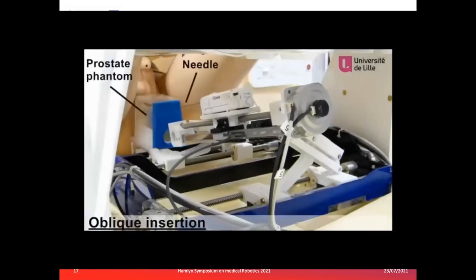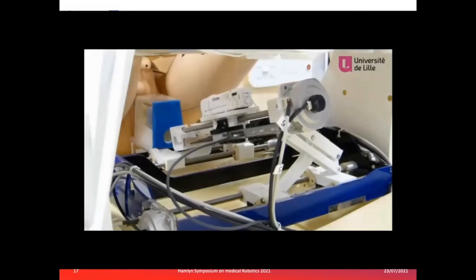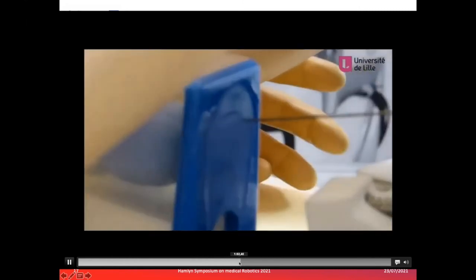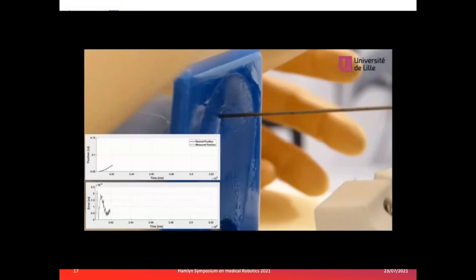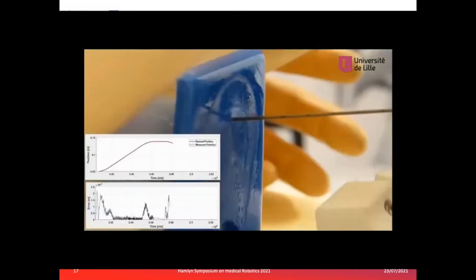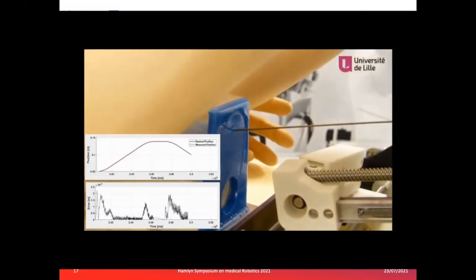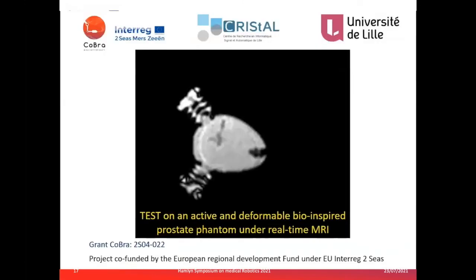We emulate the target with a conventional phantom, and the aim is to track automatically the target inside the phantom by controlling each joint separately. We can see how the graphics before show the tracking or the motion of the linear axis driving the needle for the insertion and extraction inside the phantom.